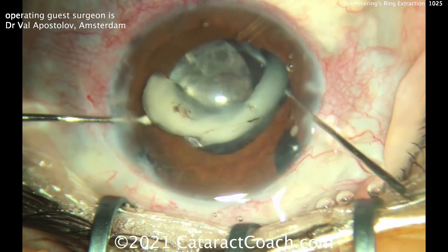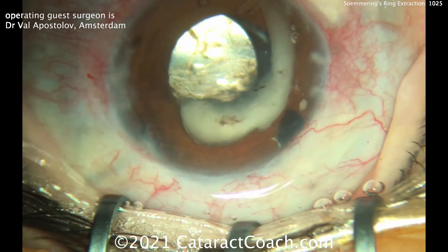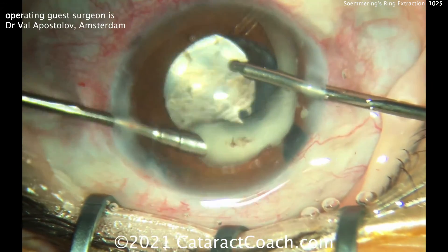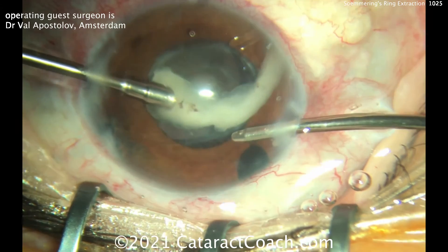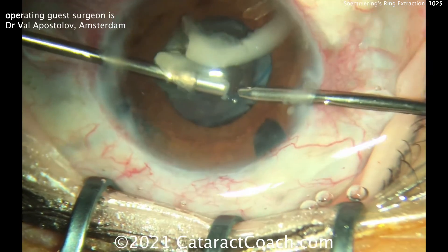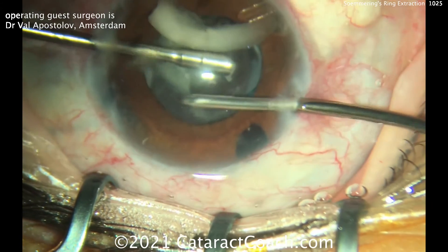Using the same technique, they're pushing it centrally right into the center of the anterior chamber. Here comes the phaco probe again — bimanual approach. He's not going to make a big incision, so no coaxial style. He's sticking with the two small paracenteses — a smart decision. You don't need much phaco energy, just little tiny bursts, just enough to emulsify it and aspirate it down pretty easily. Be careful if doing this in an eye with an open capsule — you don't want to lose any big pieces into the vitreous cavity. In this case, there's no worry about that, and this will come out quite nicely. He'll then go on and do the glaucoma procedure as well.